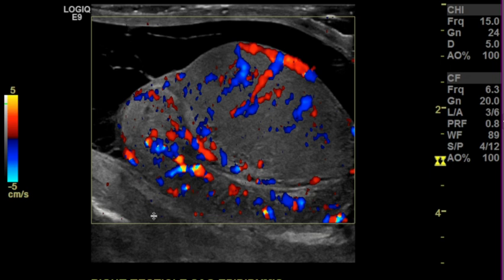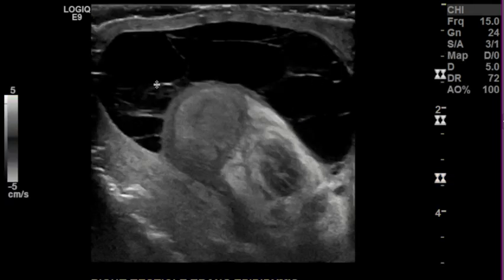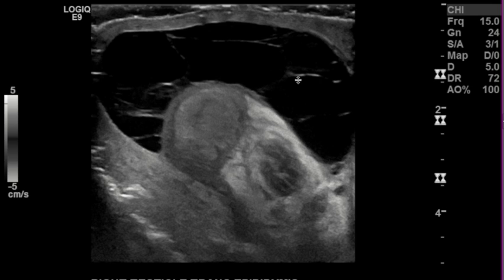This looks like a case of epididymitis. The hydroseal around it has septations — this is a complex hydroseal, which can be seen as a sequelae of epididymitis. This epididymitis is likely what's accounting for the patient's right testicular pain.